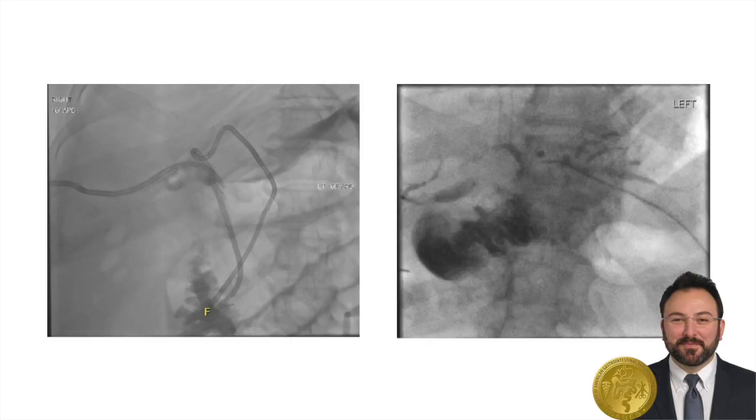Ultimately, this patient had an E4-type injury with the right anterior, right posterior, and left bile ducts all injured during the laparoscopic cholecystectomy. Antegrade cholangiogram the next day demonstrated that the right posterior system had some free leak, so an internal-external catheter was placed. At that point, there was good opacification from all three repairs.